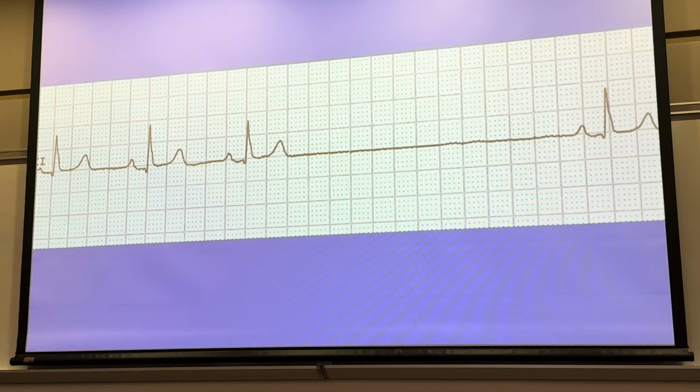Don't really have to worry about this unless this happens more frequently. Occasional sinus pause, nothing to worry about.